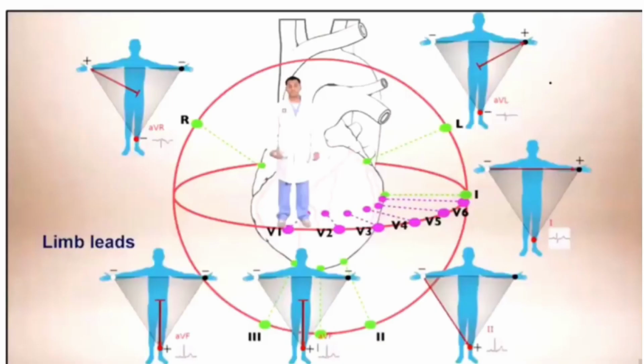As we have already discussed in previous blogs, the precordial leads are V1 to V6. Lead 1, AVL, V5 and V6 are lateral leads, leads 2, 3 and AVF are inferior leads, and lead AVR is a right-sided lead, or we can say that it sees the cavity of the heart, so it is in the direction opposite to the net direction of the vector.